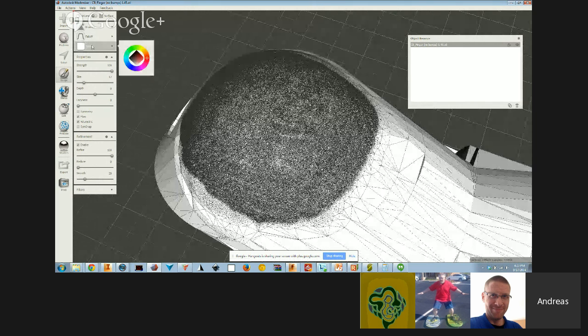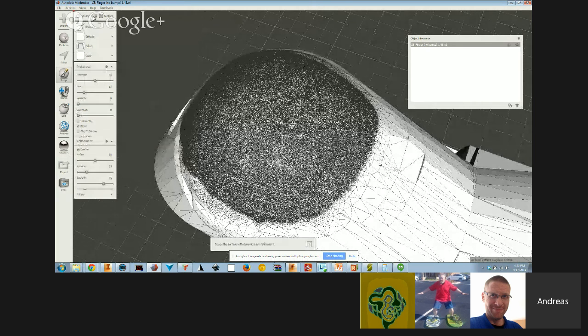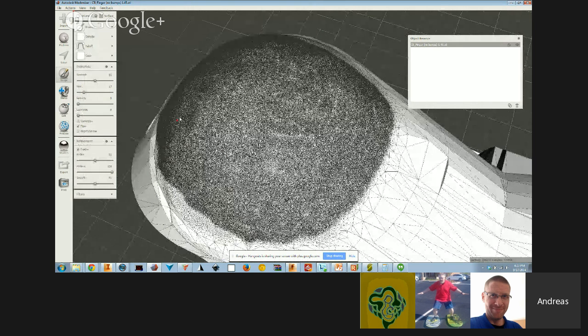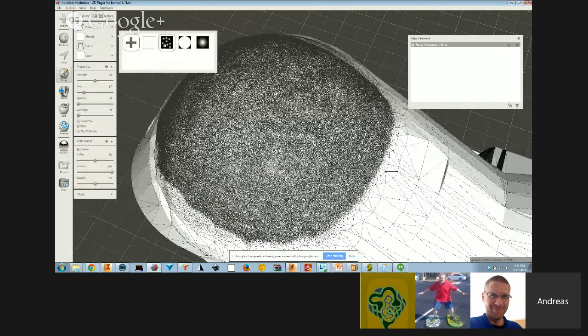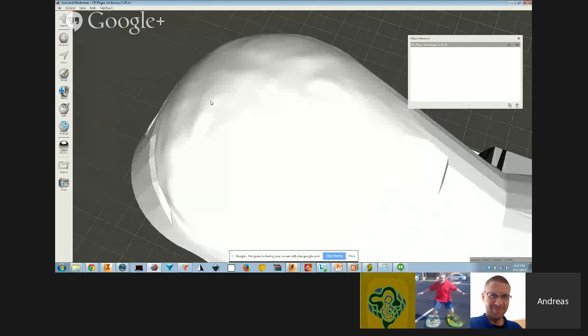So here, I use my refine brush. Now what I like to use, in the surfaces brush, is this Draw Max. It kind of is like adding putty, using a putty knife, if you will, because you can limit the amount it's coming out. Let me just show you what the brush does first, okay? So I'm going to turn off the W now, just so you can see this.